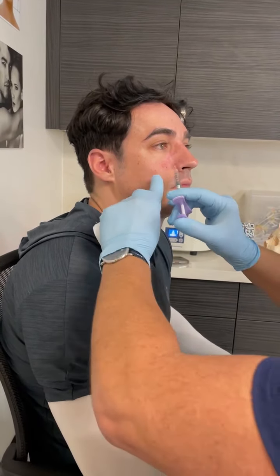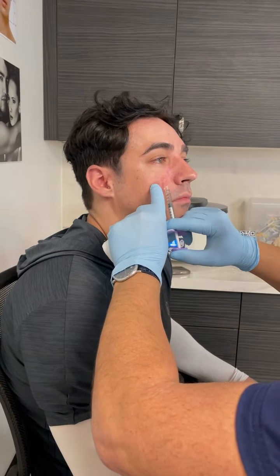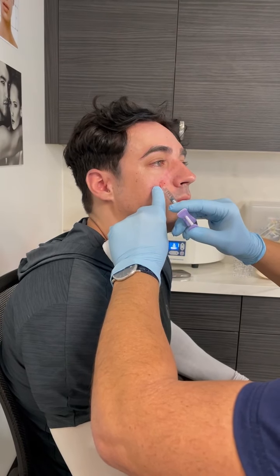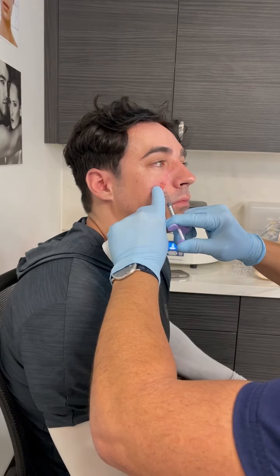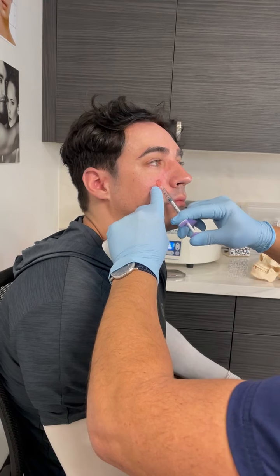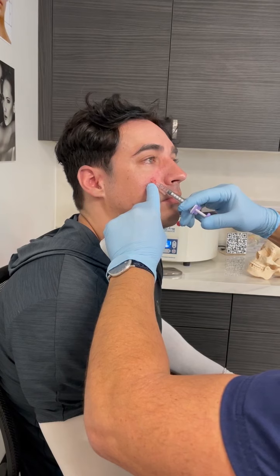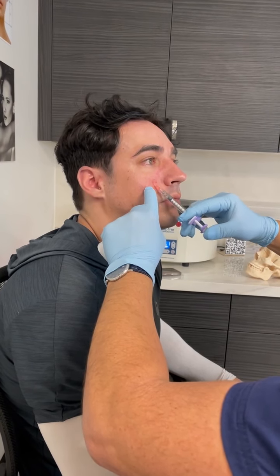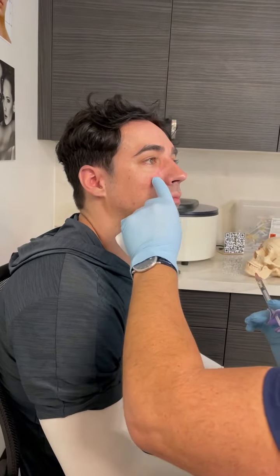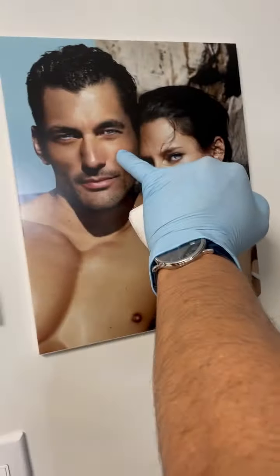So now you see the flatness there. So now we're gonna do the fanning technique. You're gonna go in 1/2 inch away from the tear trough. I'm touching the bone right now. I'm going to inject, pull back without going all the way out, change the angle, add more volume, pull back, change the angle, add more volume, and inject. And you could see that fullness that he got in the mid-pupillary line, similar to the fullness he has here in the mid-pupillary line.